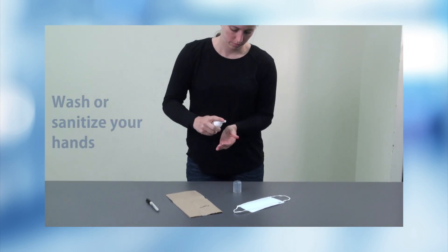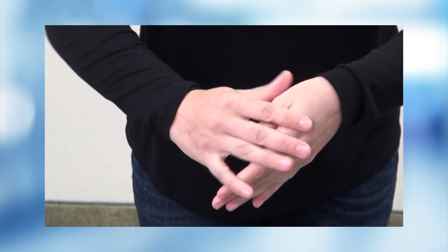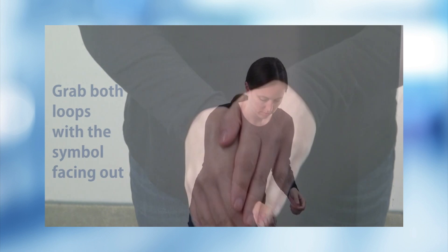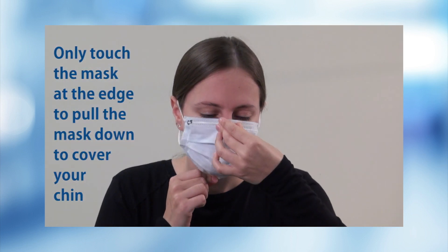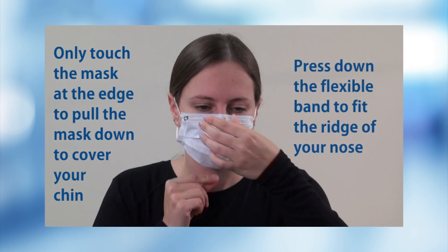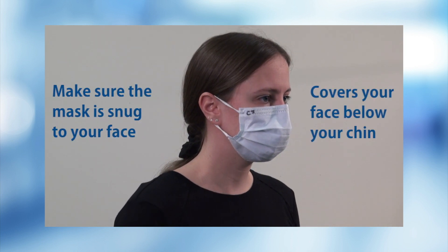When putting on a mask, first wash or sanitize your hands. Grab both loops with the symbol facing out and pull it over your ears. Only touch the mask at the edge if you need to pull the mask down so it covers your chin. Press down on the flexible band to fit the ridge of your nose. Make sure the mask is snug to your face and covers your face below your chin.